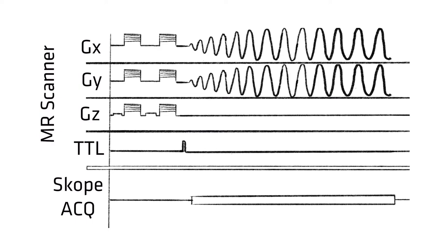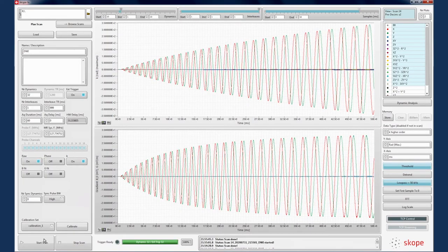Let's try three diffusion directions at B equals 1000 plus a B equals zero image. We set everything up as before, ensuring we capture the entire readout train. Hitting scan as before, we see data being processed by ScopeFX. We again see the k-space and gradient waveforms.